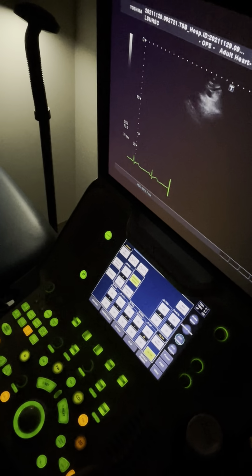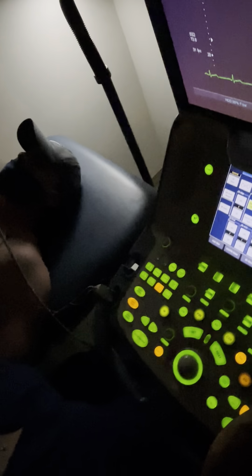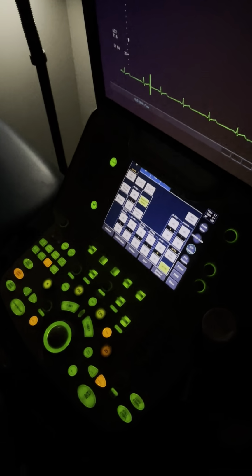my thumb is the index. It's over here towards his right shoulder. I can tell you Paul's is not going to be as easy as Kyle's was. But you have the index going towards his right shoulder. Left shoulder, sorry. My right. It's early. I haven't had but one cup of coffee. I'm going to have to stand up for this.